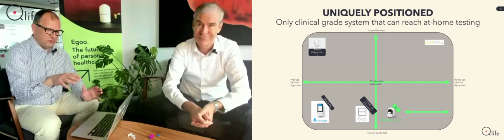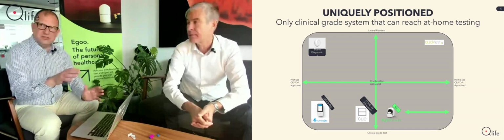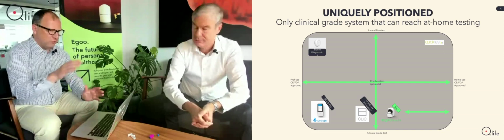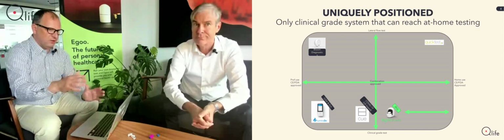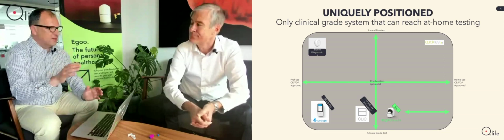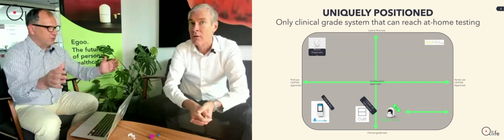Yes. Just to get back to the market, because you don't have the CE mark, this IVD ready yet, and you're working on that. That's a matter of how many assays you actually use, and of course other stuff. And with that said, your focus right now is a different segment. You have a lot of segments within home testing.